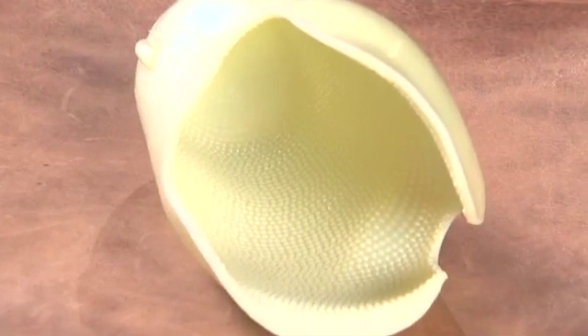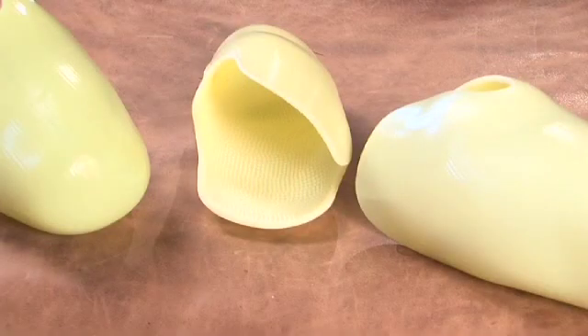This is what we call an inner socket. It goes inside the more rigid outer socket. It has corrugations throughout the whole inside of this, and those corrugations do two really dramatic things. One, they increase the surface area on the inside of this socket by 100%. So we've got a lot more area to bear weight, to transfer loads, to control the environment that we're dealing with and the liners that we're wearing.